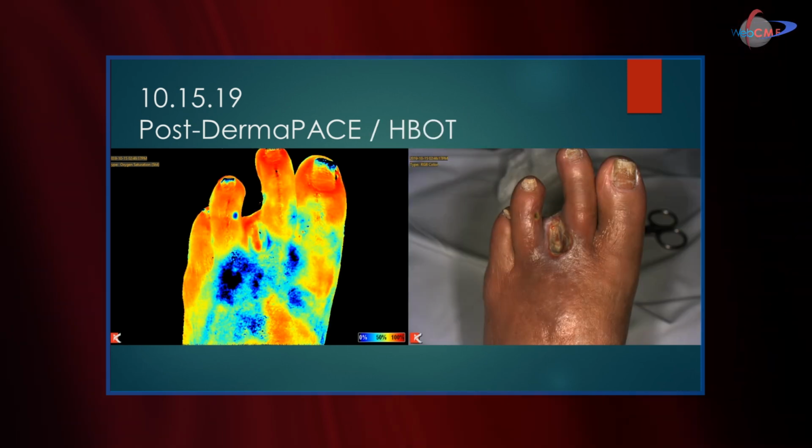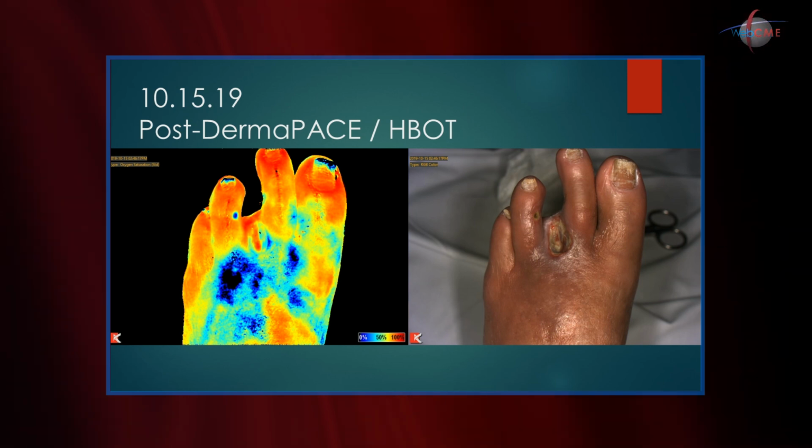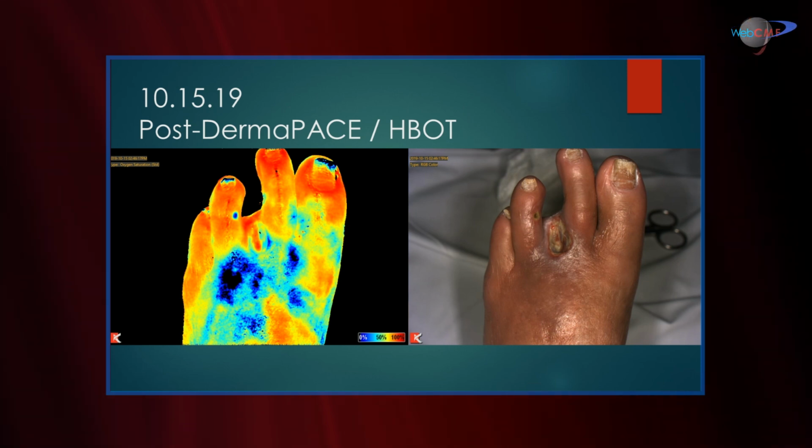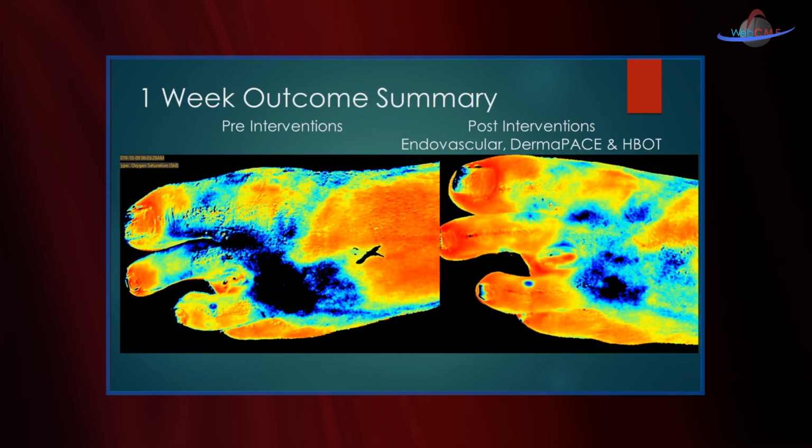So we combine the two, and again, I think you would see and agree that this shows a nice improvement in that area. And if you look at that space where the wound is, we're getting some nice oxygenation and perfusion of that tissue, which is going to correlate to healing. So this is a 1 week outcome summary.